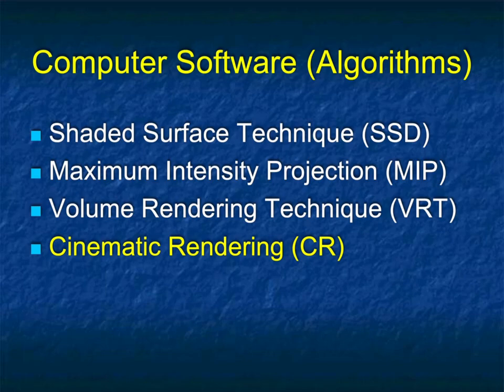And then in the mid-1980s, Pixar came along with volume rendering. Remember that RGB, you could look at any tissue type. Things weren't zeros and ones. You could have partial pixels with soft tissue and bone or soft tissue and air. And then, of course, what we're going to focus on today, it's what's come about most recently over the last 5 to 7 years, cinematic rendering, which is a form of volume rendering, but it takes advantage of the very fast chip speed and capabilities to really do a lot more than we ever could do before.